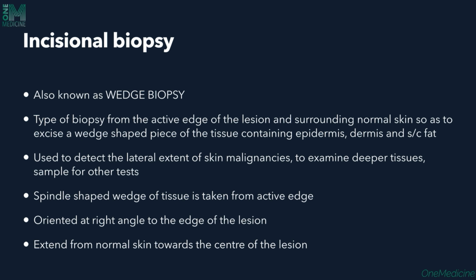Incisional biopsy is also known as wedge biopsy, wherein if this is a particular lesion here, part of the lesion is taken into consideration here. Okay, wedge shaped part of the lesion is taken for biopsy. The active edge of the lesion is taken for biopsy with the surrounding normal skin as well.